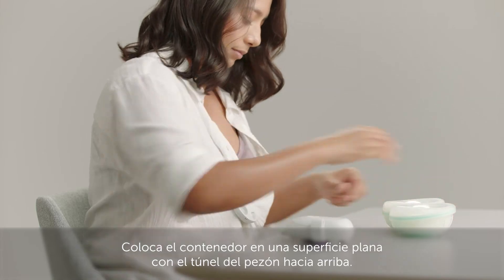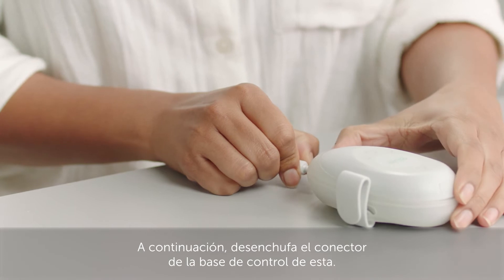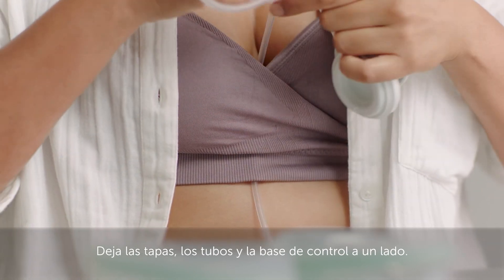Place the cup on a flat surface with the nipple tunnel facing up. Then unplug the hub connector from the hub, and put the caps, tubes, and hub to one side.